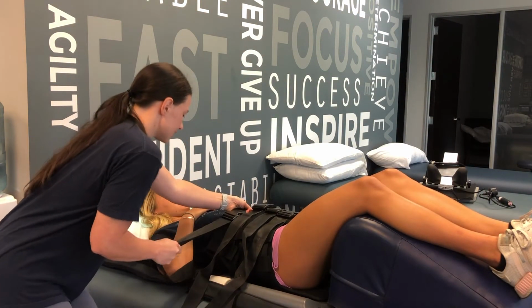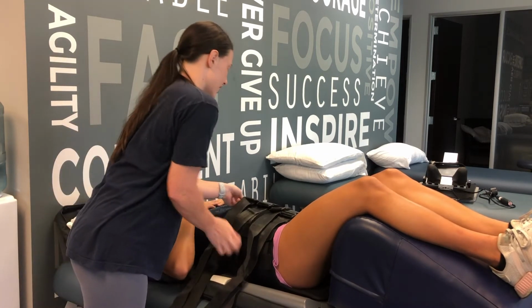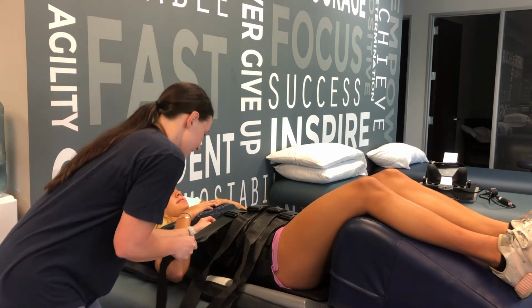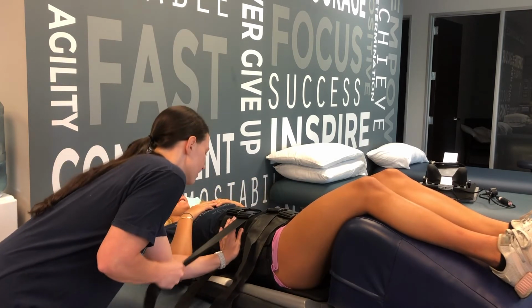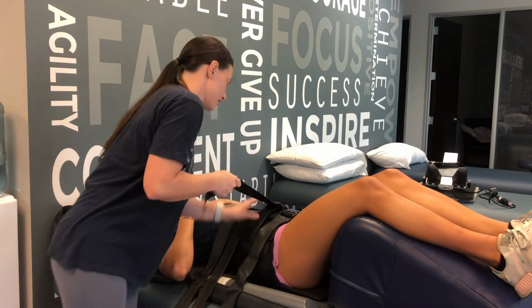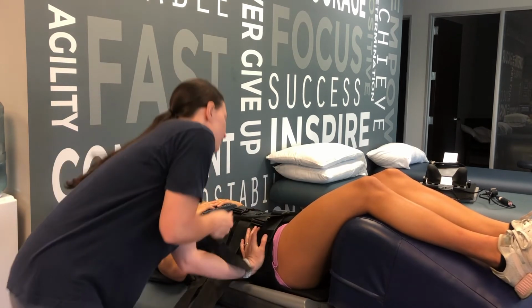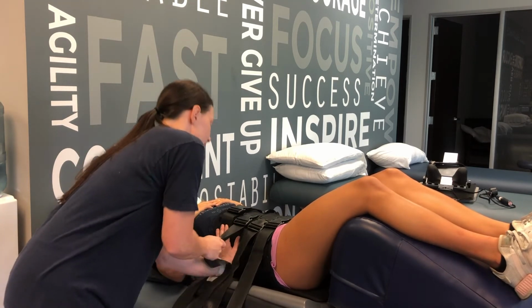I might go from this side. Usually hold it in place and kind of pull. The top one is the one you don't want to be way too tight because it is over their lungs, and you don't want to prevent them from breathing. All right, does that feel pretty snug but not too tight? Mm-hmm. Okay.